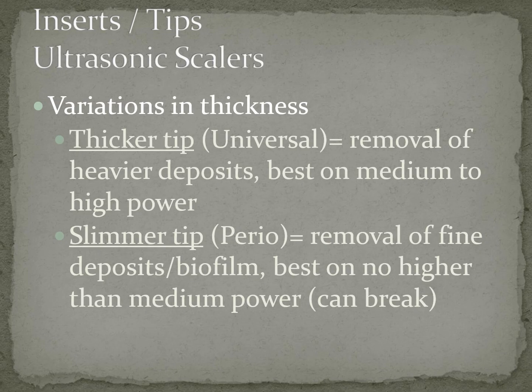Let's talk about ultrasonic inserts or tips. There's thicker tips, there's smaller tips. So the thicker tip we refer to as our universal, and we are going to use it to remove heavier deposits. And we need to make sure that we have the instrument on at least medium to higher power. So it's not going to work as well if we have that on a lower power.